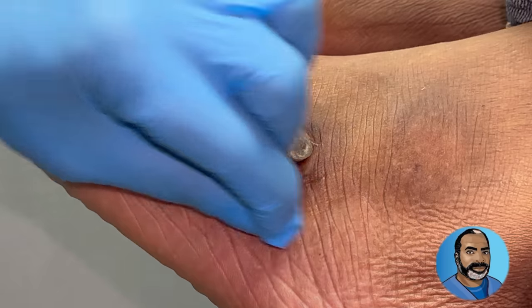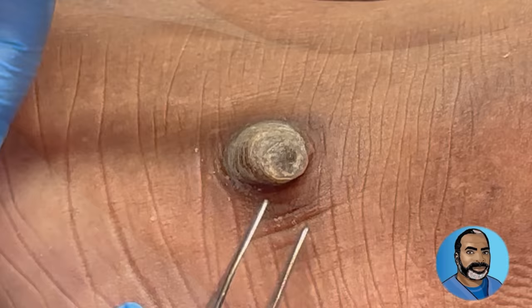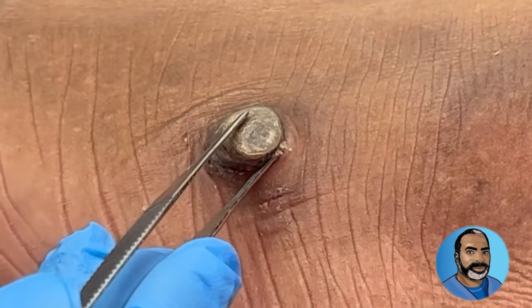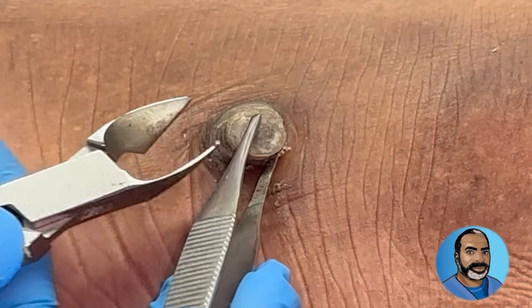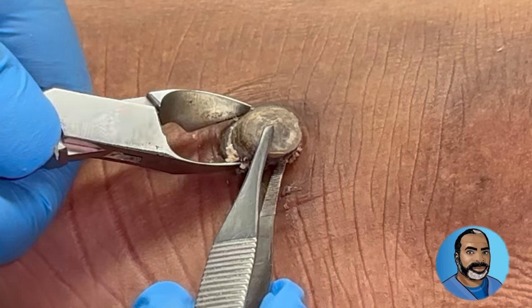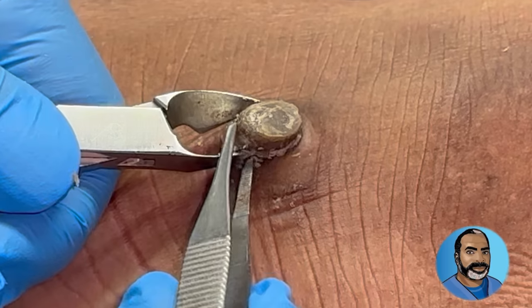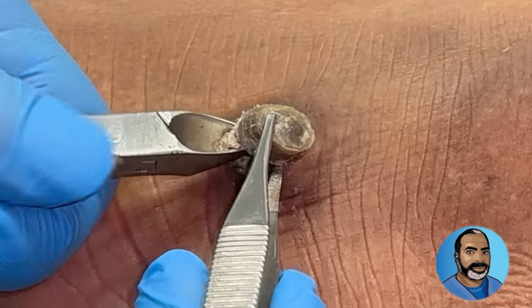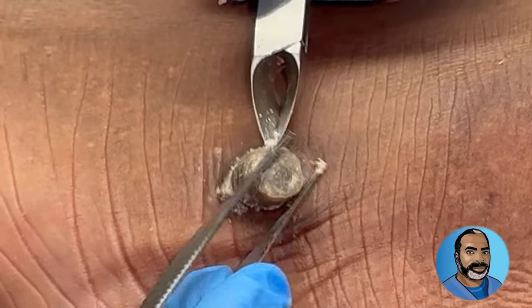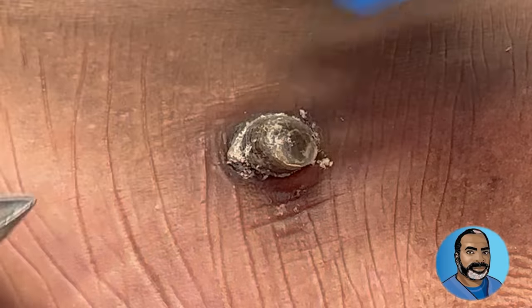All right, let's see what's going on here buddy. I'm going to use my tissue nipper first because I know the blade's not going to go through this — it's too hard for that. So far it's not reacting, so we don't have to give him a shot. I might have to hold him down.